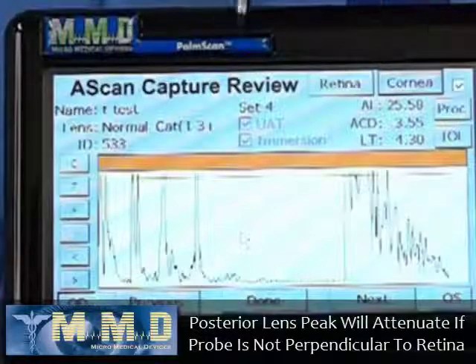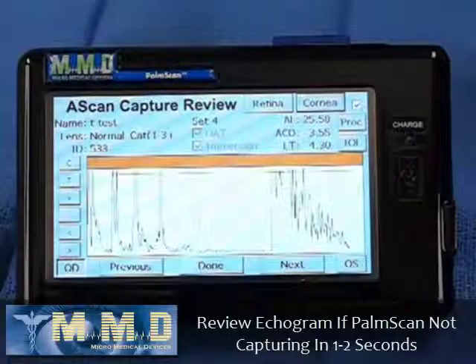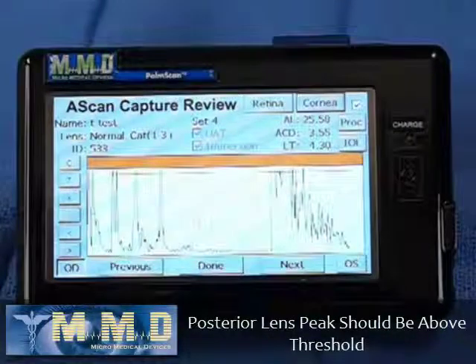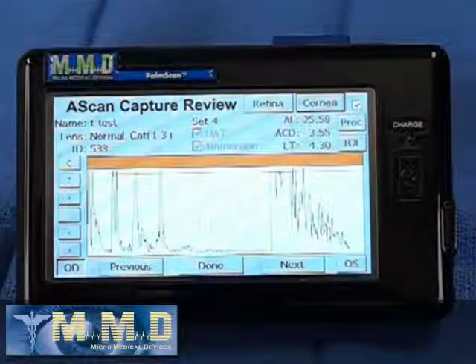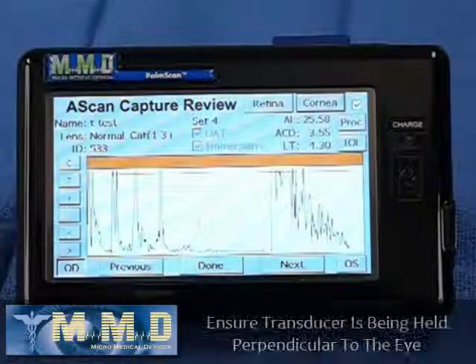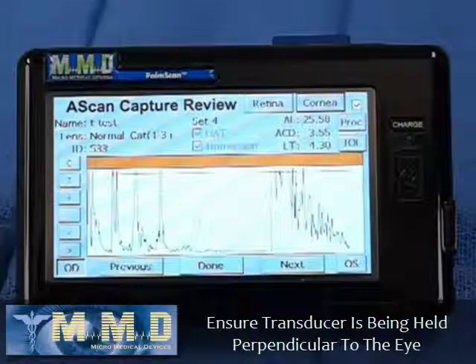So if you place the PalmScan on the eye and it's not capturing after 1 or 2 seconds, we recommend that you look at the echograms and make sure that the posterior lens spike is above threshold. And to do that, you might just have to realign your transducer in relationship to the patient by instructing them to look directly at the blinking LED, and also make sure that you're holding the transducer perpendicular to the eye and not at an angle that prohibits the eye from being perpendicular to the transducer.